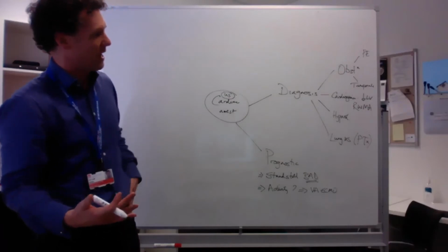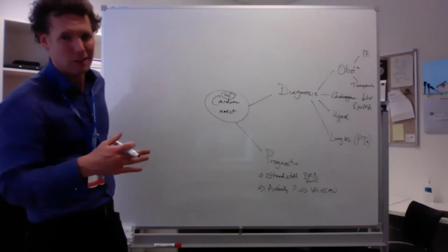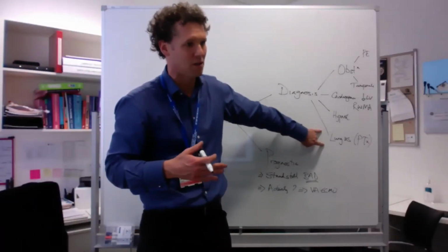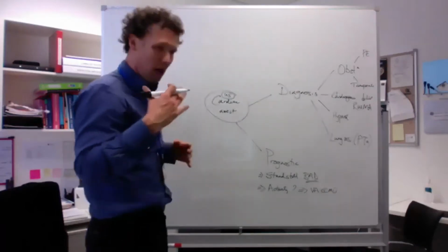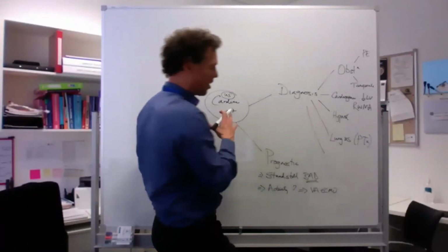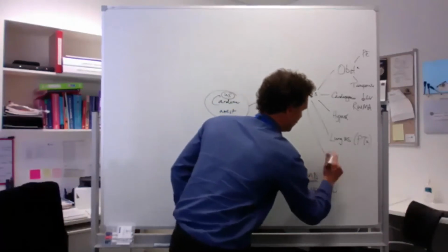If it just says echo, I'd probably mention it, but I wouldn't spend too much time there because I use the same probe. I think with echo they're generally just talking about the heart. But with ultrasound, bring in general ultrasound, because with sudden cardiac arrest, non-traumatic, I'll just write general.